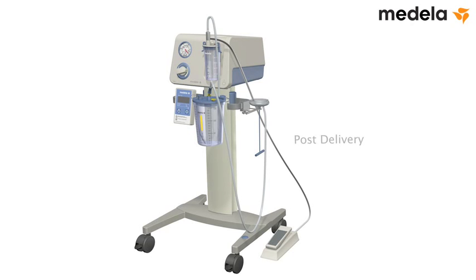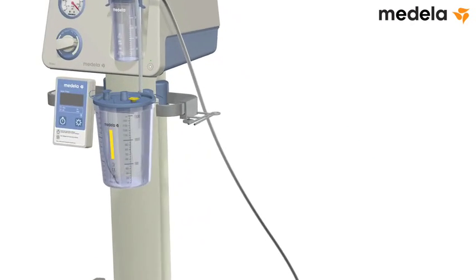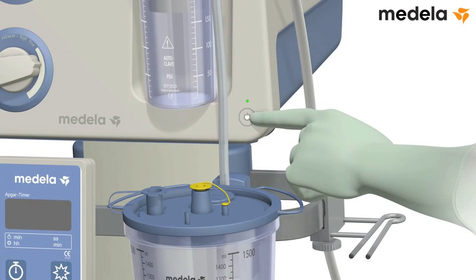Post-delivery: disconnect the sterile tubing and the angle piece, and discard them together with the cup in accordance with hospital policy. Use the plug to close off the patient port. Turn off the pump.